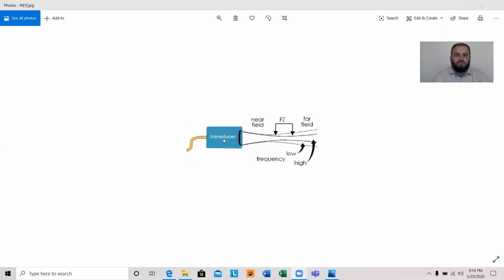Let me show you in one of the images how it works. Let me share my screen with you guys. Okay, this is one of the ultrasound transducers. If we see, sound goes all the way this way, but this is your focus area. On the focus area, we have to put our focus. It's a movable structure, or a movable system. So you can take it where you exactly want it to. It has to be on the area of interest.